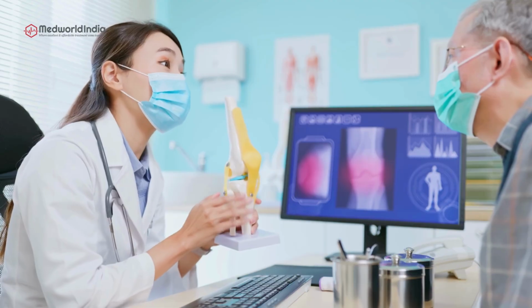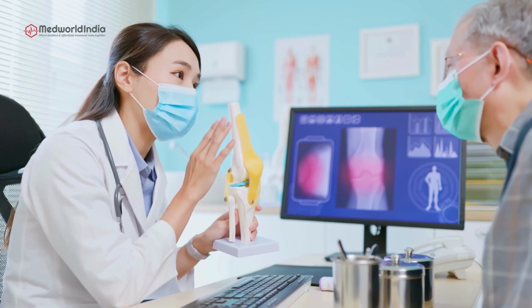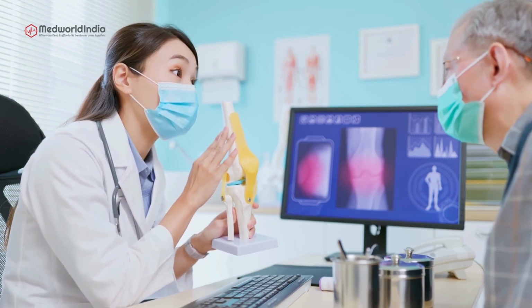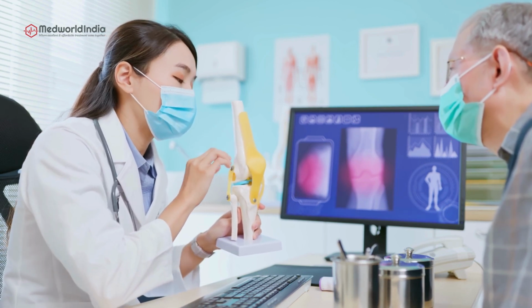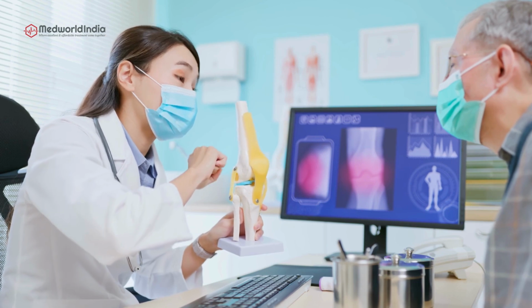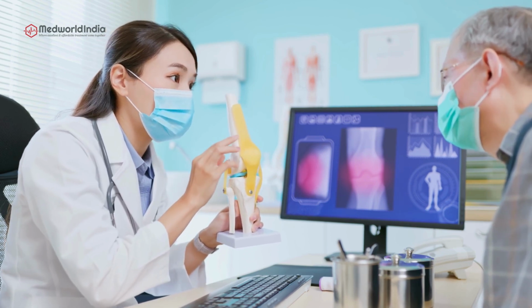4. Total knee replacement, also known as total knee arthroplasty. The most common surgery for advanced arthritis, involving replacing the entire knee joint with a prosthetic implant. Effectively relieves pain and restores mobility for most patients. Recovery can take several months, with full recovery taking up to a year.